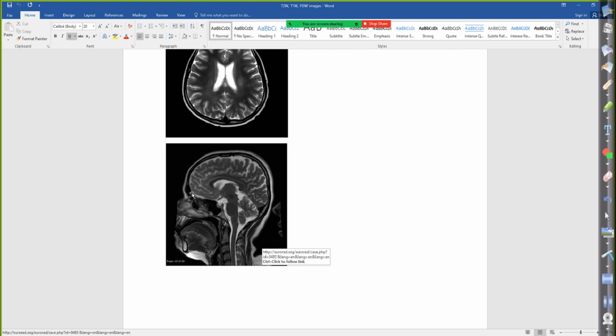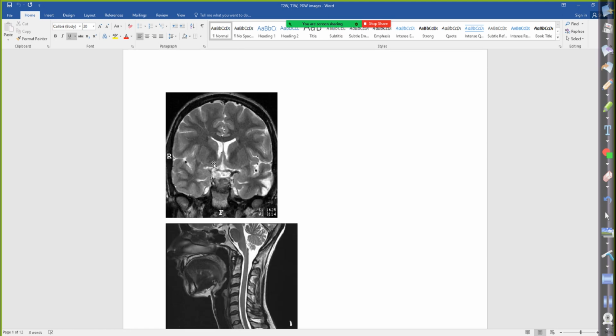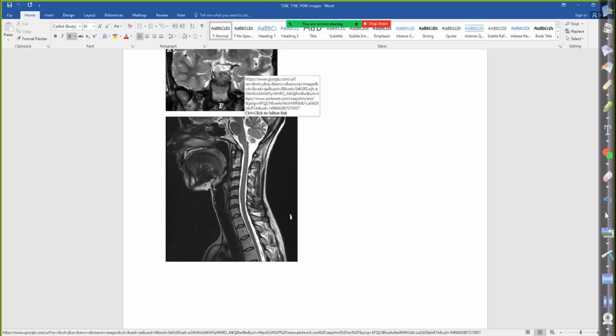Okay. We don't have the globes of the eyes to go off of because we're right in the middle of the patient's body. Right? Here's a coronal of the brain. Once again, these lateral ventricles. But we also have the CSF surrounding the brain, going into all the different grooves of the brain. Moving down to the C-spine. Okay, we're starting to get away from the CSF in the ventricles, but we see the CSF surrounding the spinal cord, which is a darker structure. Okay.